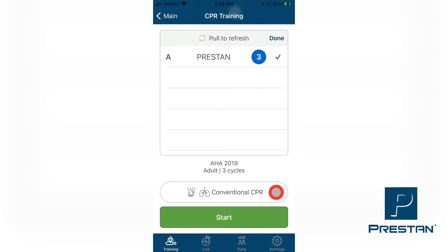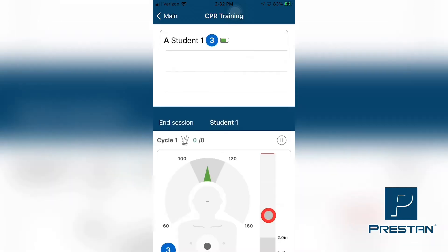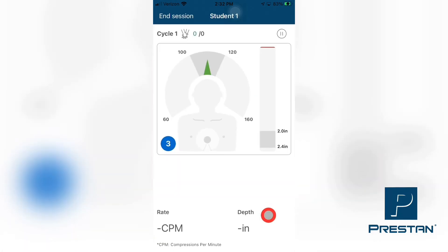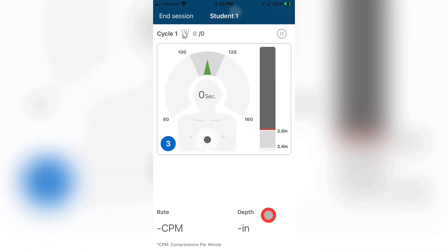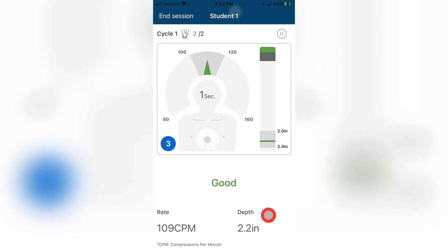The selected method will show on the face of the button. For instance, if you are wishing to train a Conventional CPR method, the button will show the words Conventional CPR. You are now ready to start the training. Press the green Start button at the bottom of the screen, and your students can now start practicing and gaining confidence in their CPR skills.